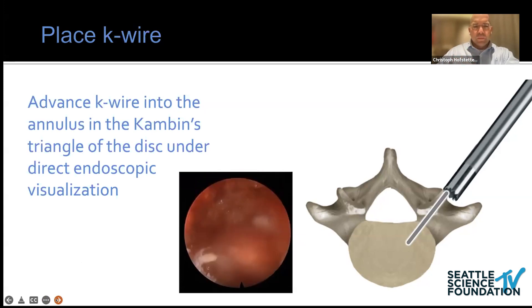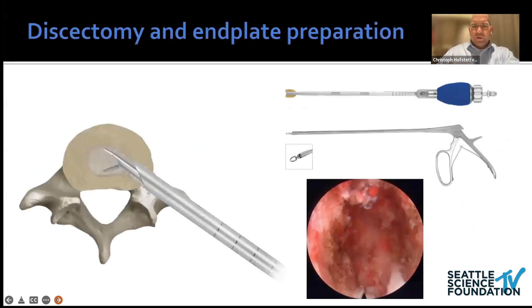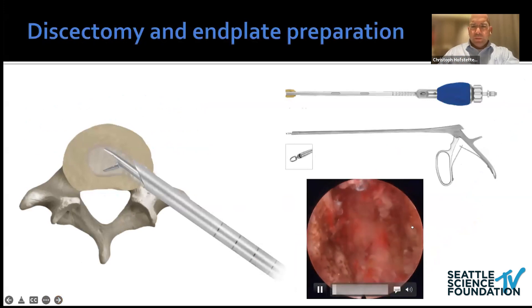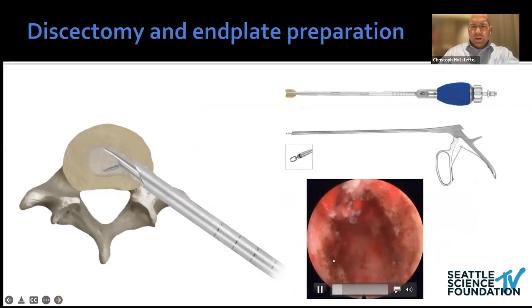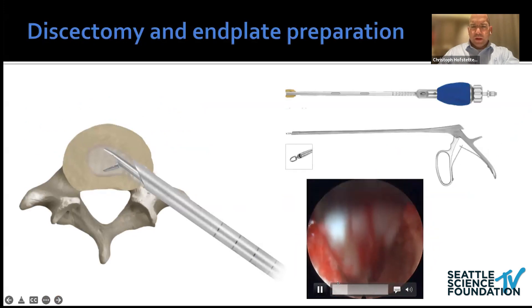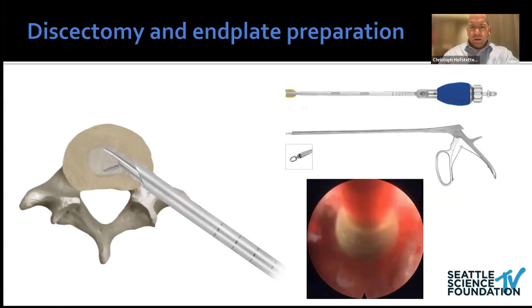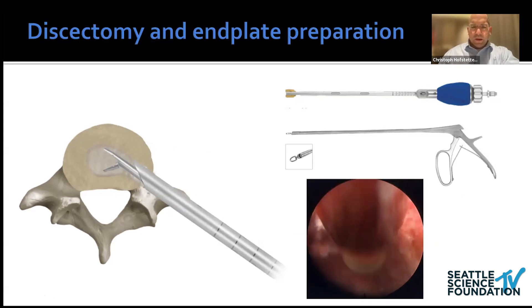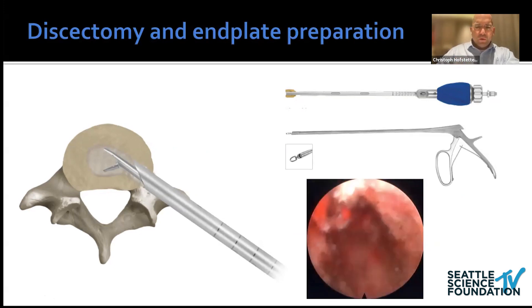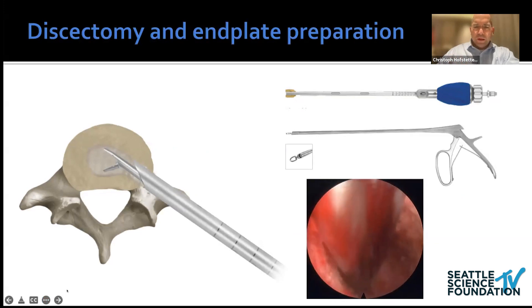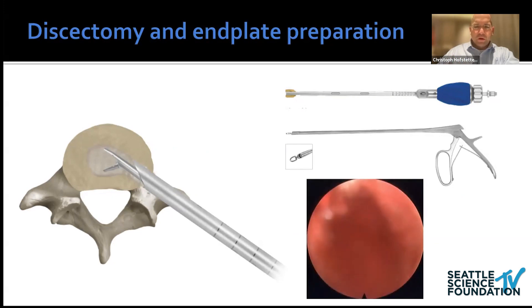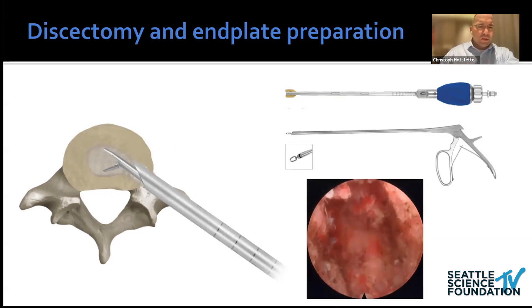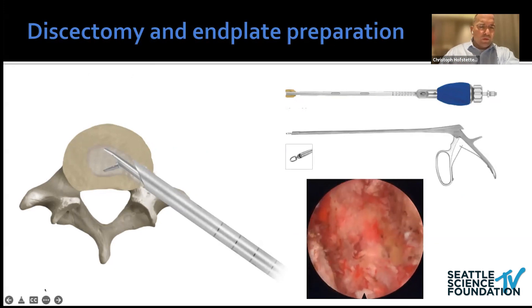Then you do the discectomy — there are a lot of tools for that, and I'd encourage anyone interested to look at the different companies. Here's the endplate preparation you can see at the end of the case — the quality is quite nice. You can take off cartilage, drill a little, and get a very nice complete exposure of the endplate. The first time you see it, I'd encourage any open or MIS surgeon to do this — you can see how much cartilage is left even when the rasp feels okay. It's a very humbling step.